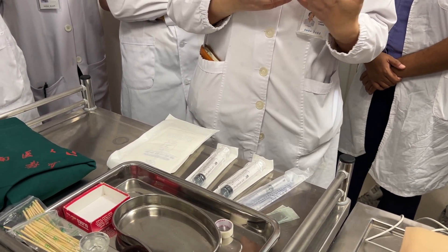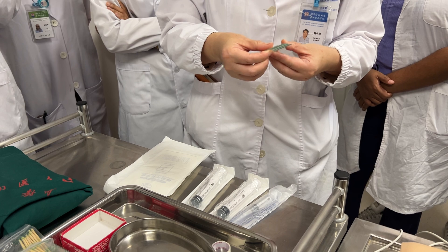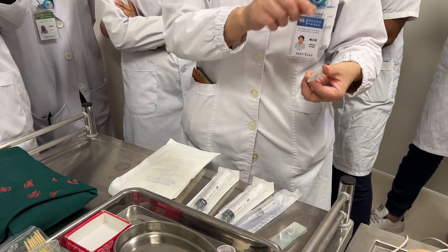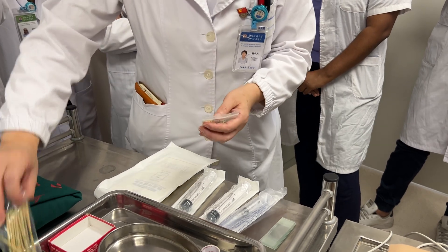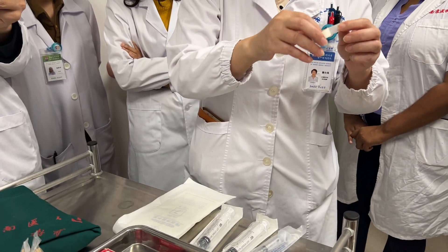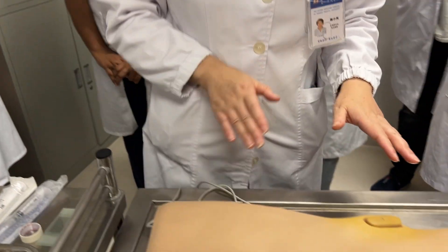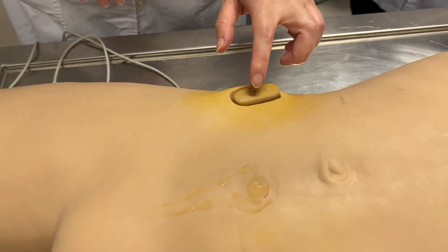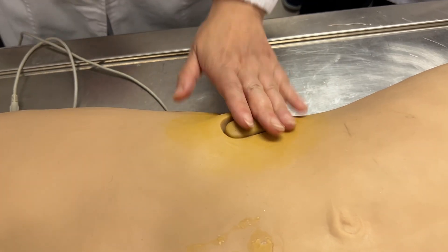We must also prepare some slides, because these slides will be used for the bone marrow smear. We also need this dressing material to stick on the skin. For the puncture site on this model, we select the anterior iliac crest.